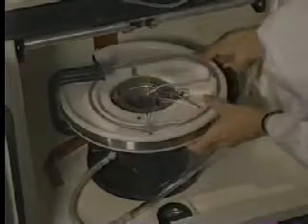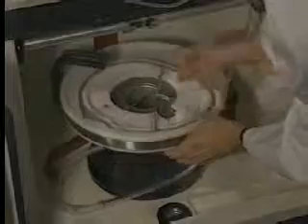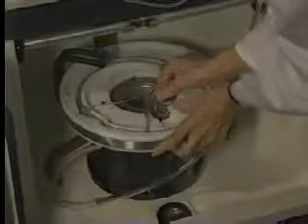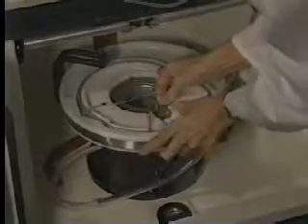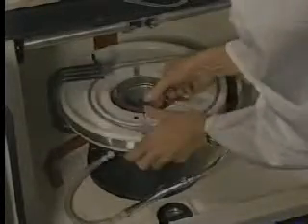Work around to the opposite side of the channel. Complete a visual inspection to make sure that the channel is properly seated all the way around the filler. Press the 4 tubes into the appropriate slots in the filler, ensuring that all tubes are completely inserted.